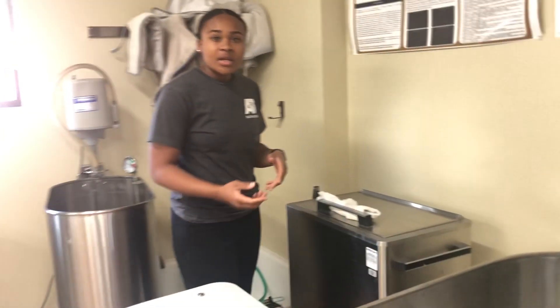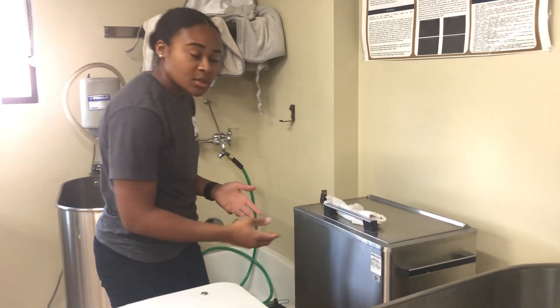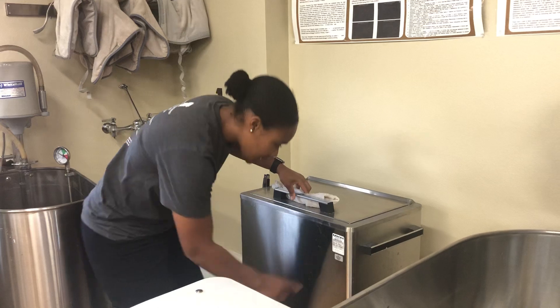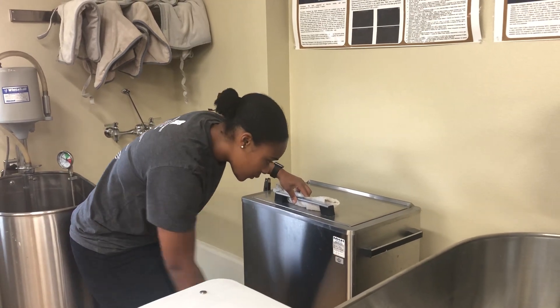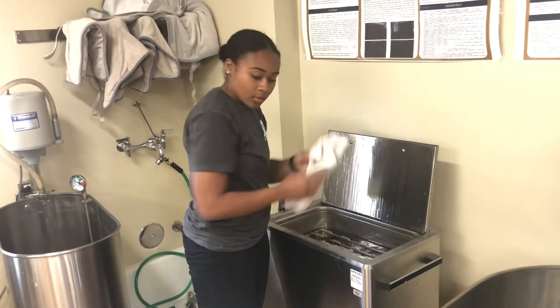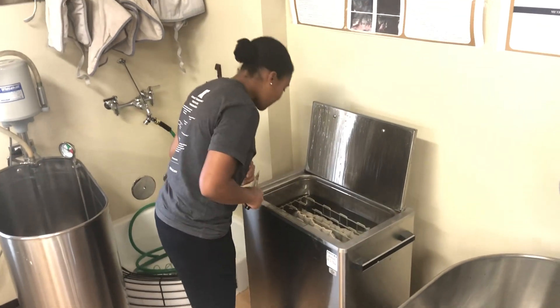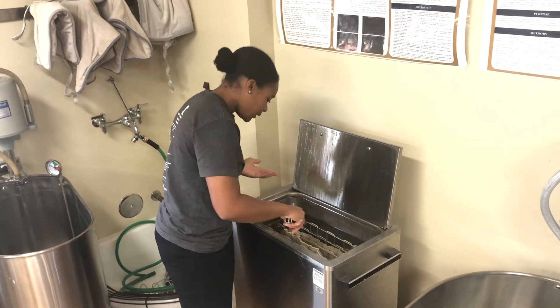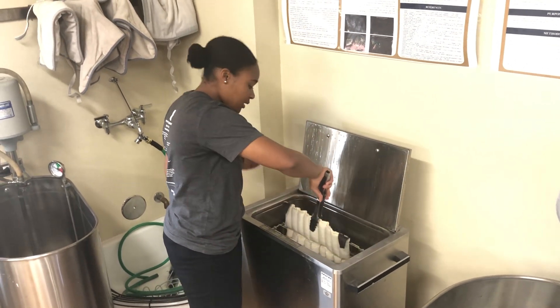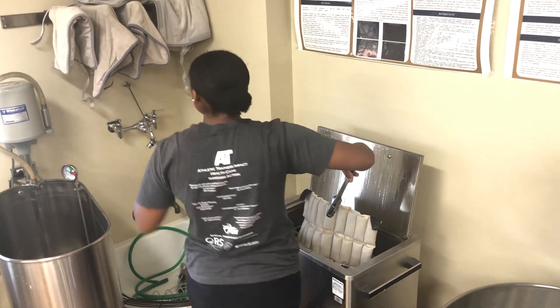When using a hot pack, you want to make sure that you come to the hydroculator and inspect it. We're looking for calibration as well as the hygiene of it. The calibration is within the range of inspection, which is great. We're going to open it using our tongs and check the hygiene. It's clean, and I want to make sure that it's 160 to 166 degrees, which it is.